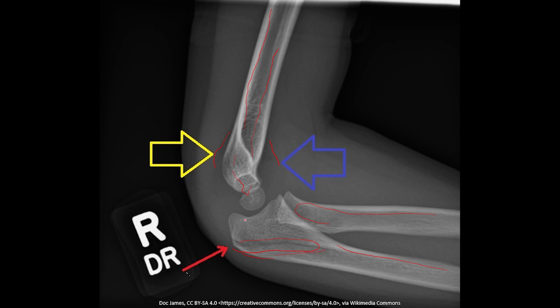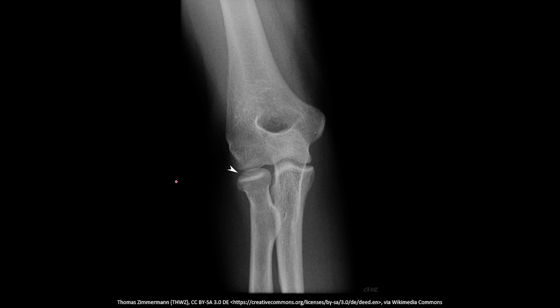We then assess the joints in step two: the radio-humeral joint articulation between the radial head and humerus, and the articulation between the trochlear notch and trochlea. We draw the radio-capitellar line from the radial neck — it intersects the capitellum normally. We draw the anterior humeral line, which intersects the middle third of the capitellum. In soft tissue assessment, we find elevation of the elbow fat pads.